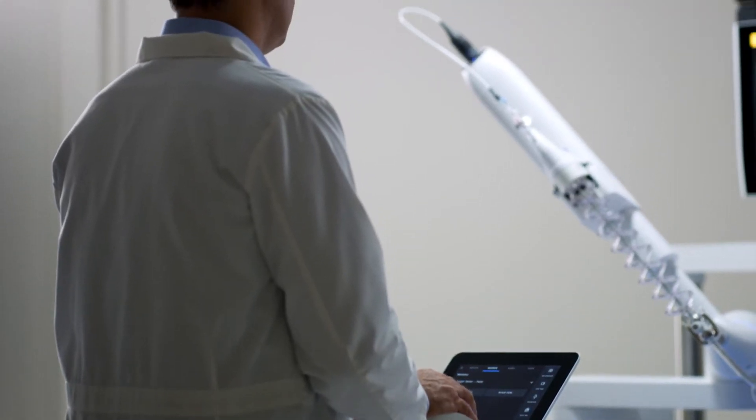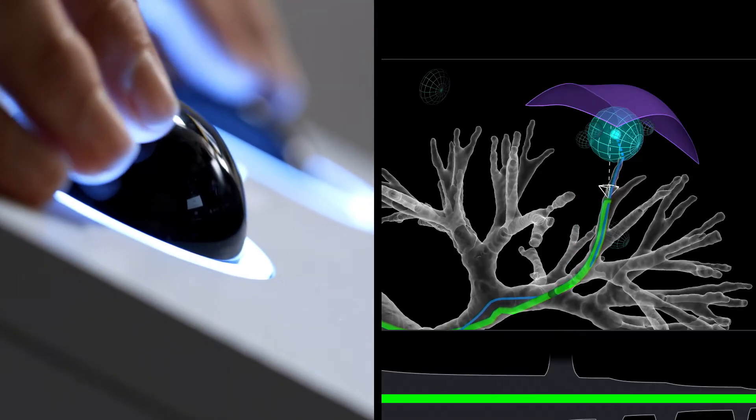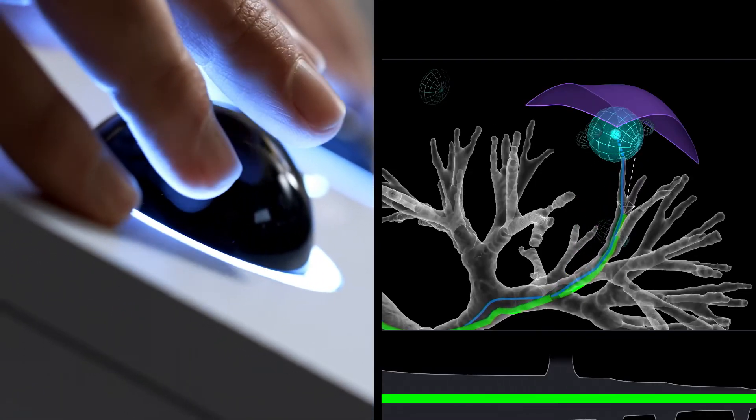We designed IRON to perform precise and accurate biopsies deep in the peripheral lung. Physicians can repeatedly biopsy the same target while systematically changing the sample location in the same area.